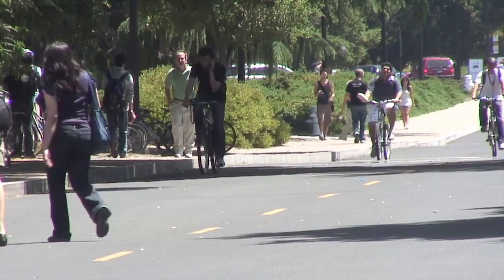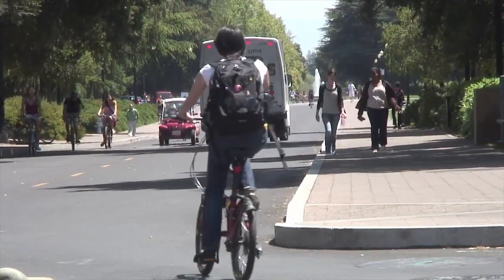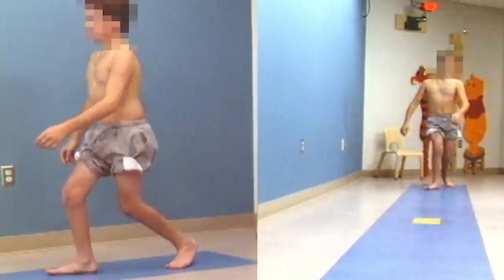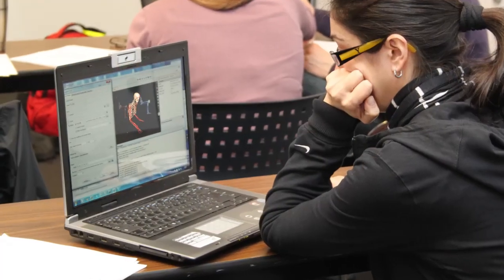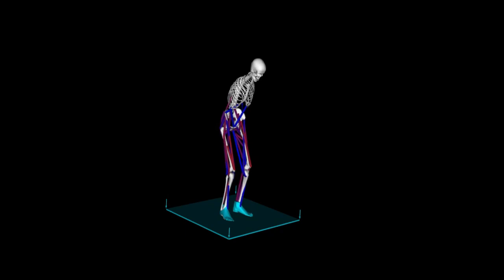Movement comes naturally to most of us. We run, we ride bikes, we walk to work. But diseases that affect our muscles and bones make these simple motions not so simple. OpenSim provides scientists with a platform to understand motion. OpenSim is a software program that lets you create highly accurate models of humans and animals and how they move.